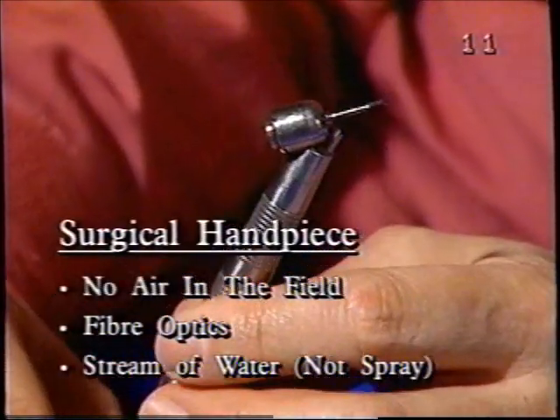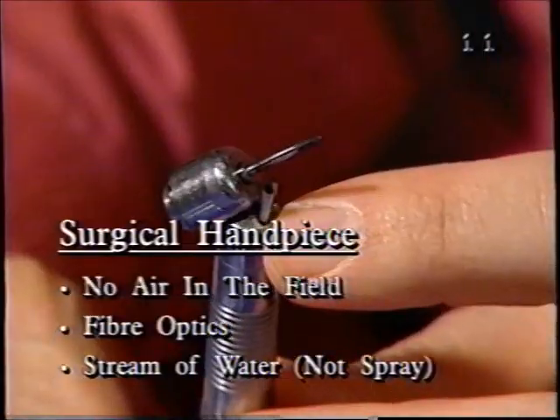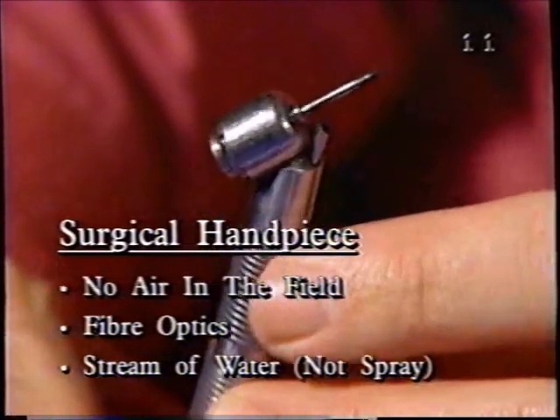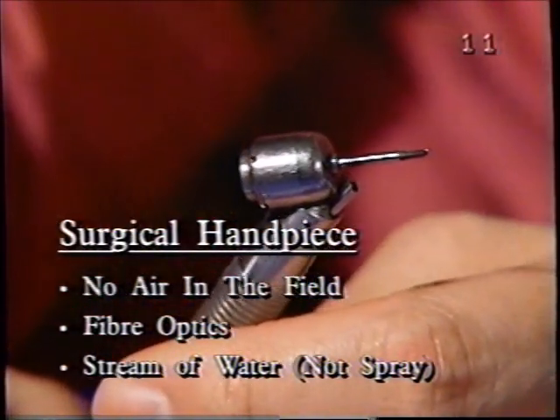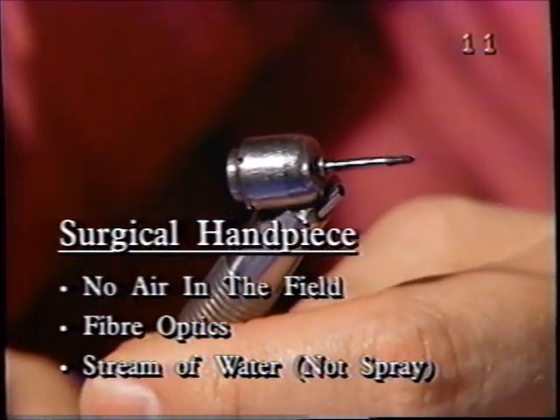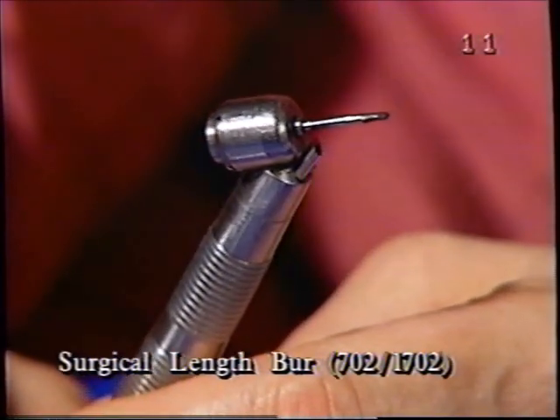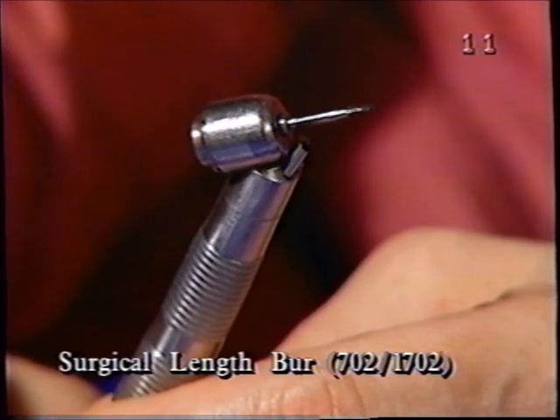We've got fiber optics. We have a little portal right here through which a stream, not a spray, of water emerges and hits the cutting portion of the burr, splashing then into the field. It also accommodates a surgical length burr, and in this case on here we have a 1702.